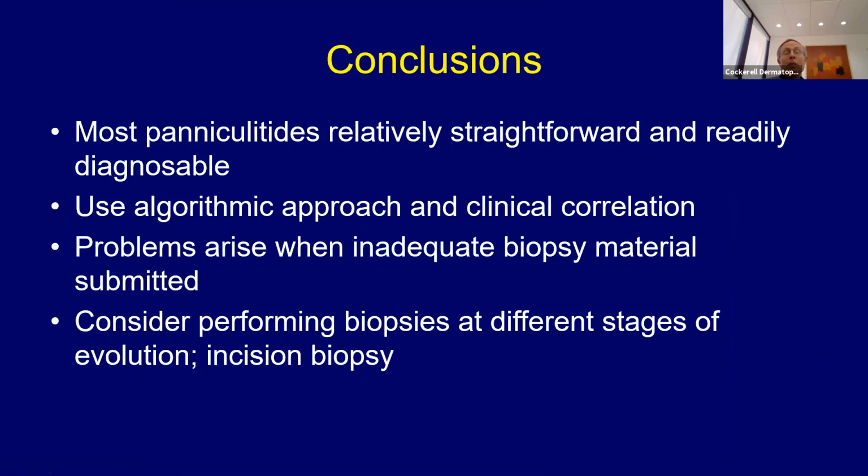I think if you get biopsies on the board examination, you get some pretty classic examples, say, of erythema nodosum, maybe nodular vasculitis. You might see something like scleroderma panniculitis, might see an infectious panniculitis. So if you just remember this algorithmic approach, septal mostly, lobular mostly, with or without vasculitis, and the type of inflammation that you see, you can really work through this pretty well and make a pretty good differential diagnosis, and come up with a pretty specific diagnosis in the context of clinical information.